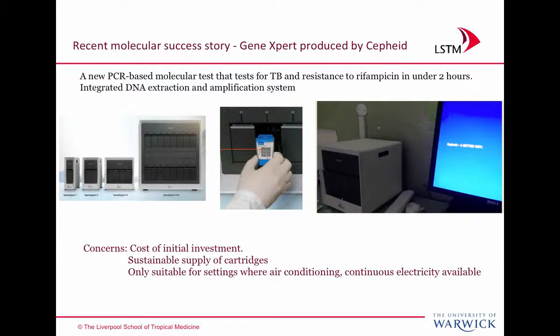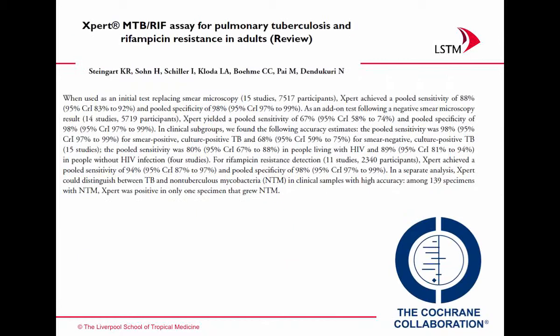But in Ethiopia, in the same lab where we're doing our VL evaluation, I'm not sure if you can see this, but this is their GeneXpert, and if you can just see on their computer screen, it says Cepheid, a better way. So they're very pleased with what they're doing, and they're very enthusiastic to go forward with these molecular diagnostics. So there's been a lot of interest in GeneXpert.